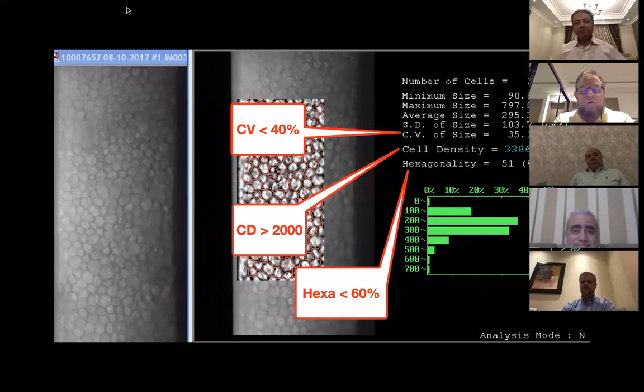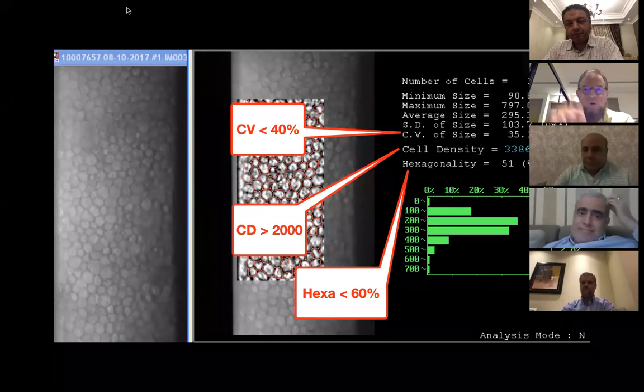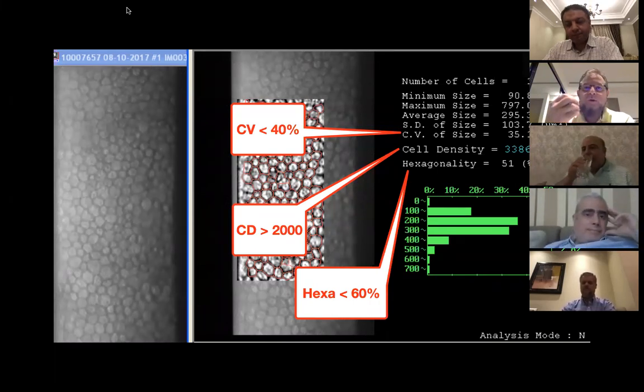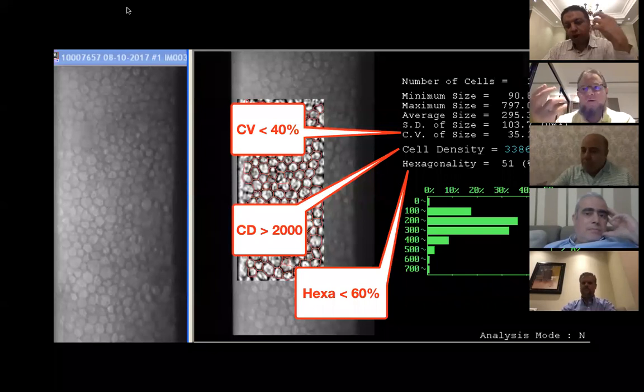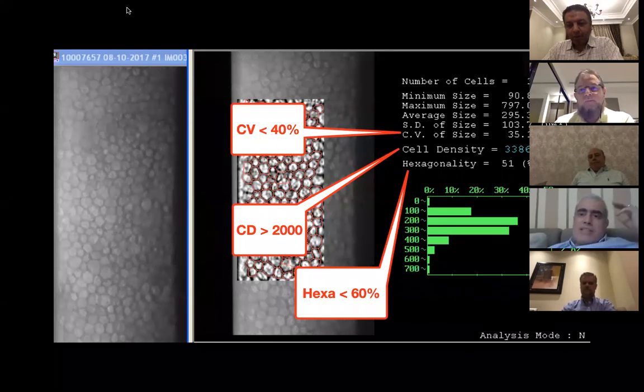I always tell my colleagues that the phakic IOL is a foreign body. I don't open the eye to put a foreign body for less than -5 diopters. I don't put a foreign body inside the eye. So I'm doing two problems: opening the eye and putting in a foreign body. So there must be a strong reason to do it. Yes, a strong reason. Dr. Yasser, what is the minimum refraction for which you go for ICL?